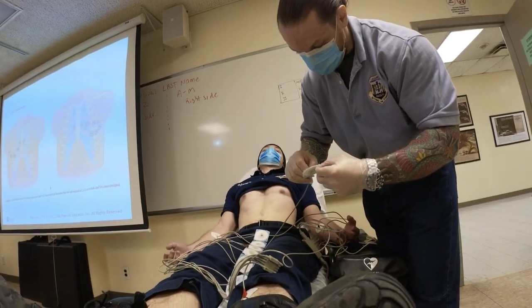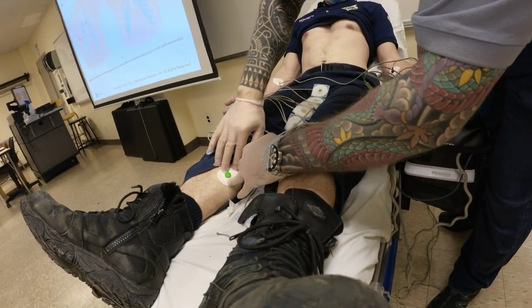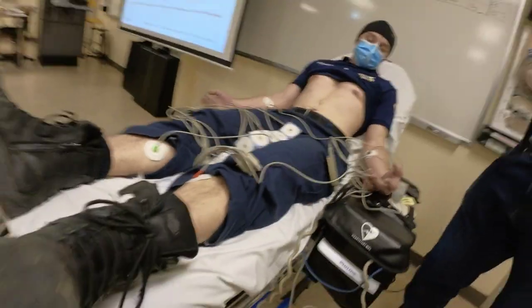This is your ground wire. Right? Do not put it over the bones. You're going to get artifact, right? Also, if the patient's cold, he's going to be shivering. You're not going to be able to get good tracing.